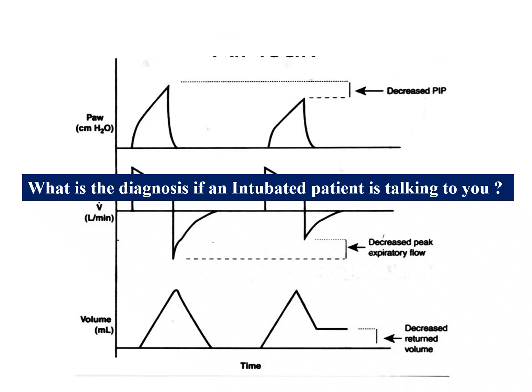What you are seeing in this curve is that you expect the area under the curve in the inspiratory and expiratory limbs to be the same, but you can see that the area under the inspiratory flow curve is more than the expiratory. So some of the air is leaking somewhere. You can even see that in the volume-time curve it is not reaching the baseline. In pressure-time also you can see a decrease in pressure. So basically this is the leak.